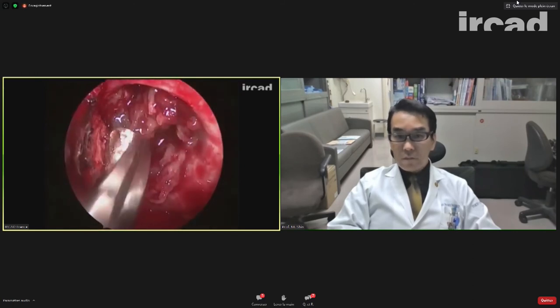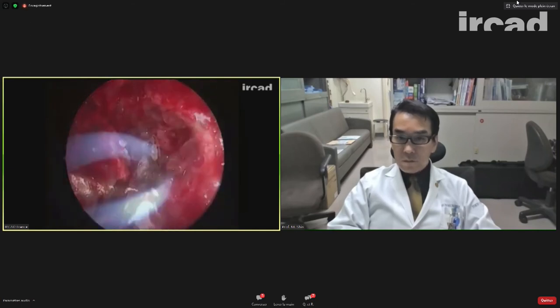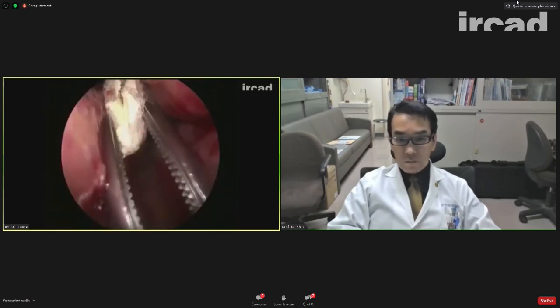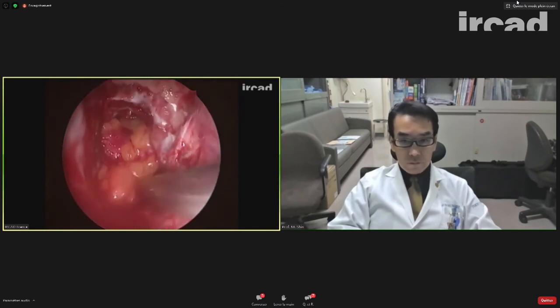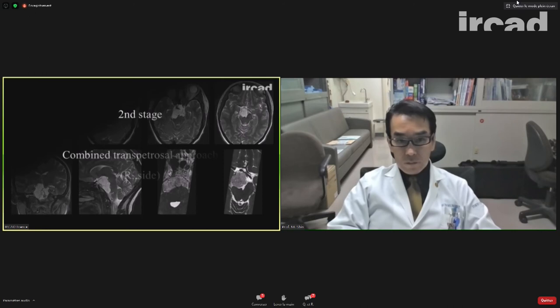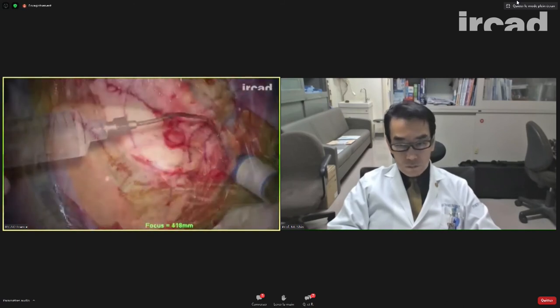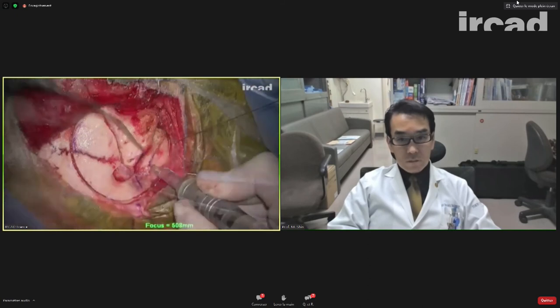The goal here was to avoid a CSF leak, because if you have a CSF leak, then you lose the advantage of the two stages. So when we started to see that we encircled the hole through which the tumor was going intradurally, when we saw the border of this hole, we decided to stop and close with the collagen material, put some fat into the sphenoid sinus, and we closed the mucosa of the rostrum. And then for the second stage, we waited almost 2 months. We wanted the scar to create a clear limit between intra and extradural, not to have a CSF leak after the transpetrosal approach, because here it's the same difficulty to close.